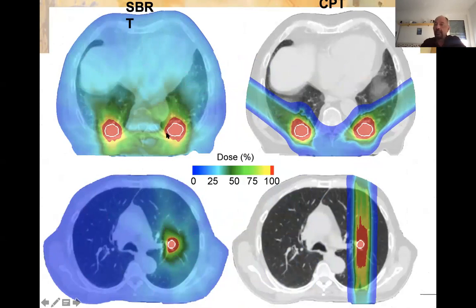You see that when you have 2 tumors, the field becomes really enormous, while you see that this is how you can treat it with heavy ions. This is a case where clearly there is a very large advantage in using heavy ions compared to SBRT. Well, if you look at this case carefully, the advantage is less pronounced. This is a central tumor. These are two peripheral lung tumors, in the top of the lungs.